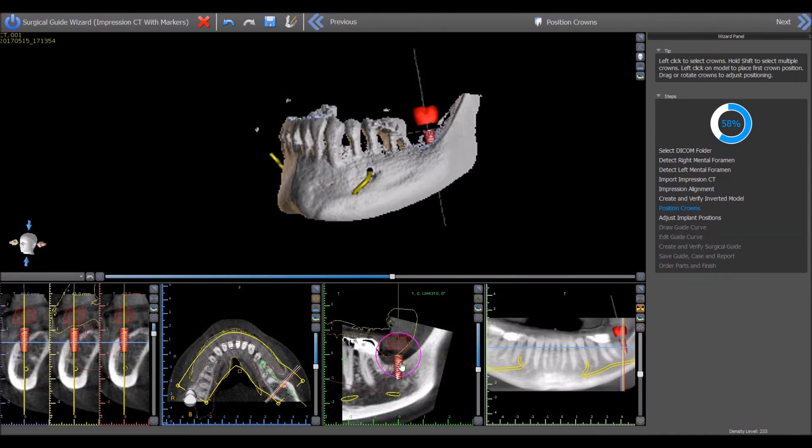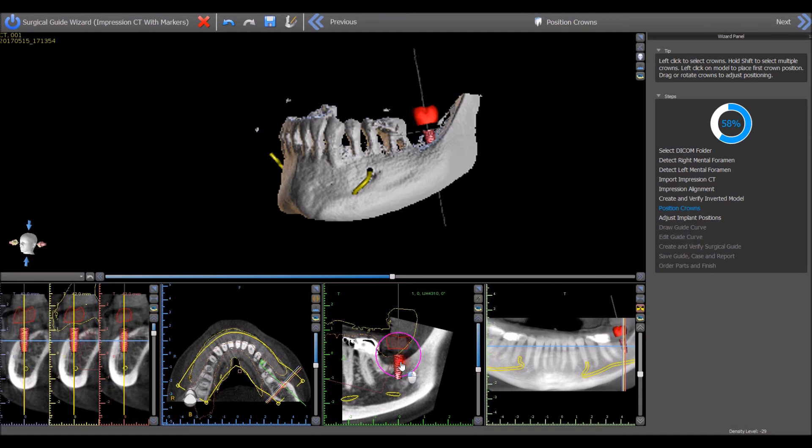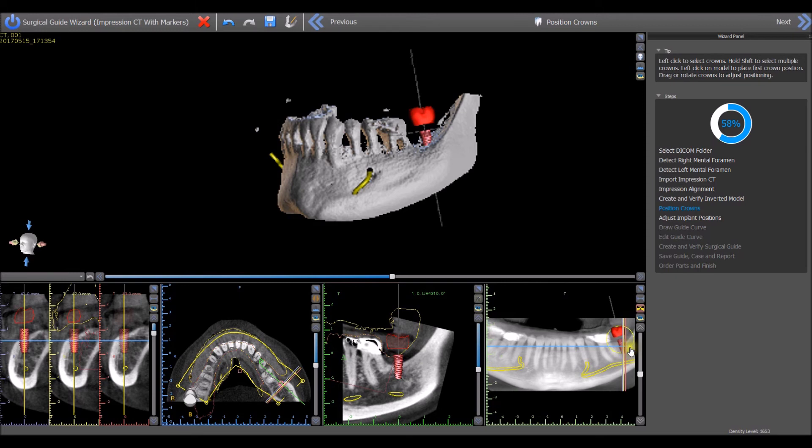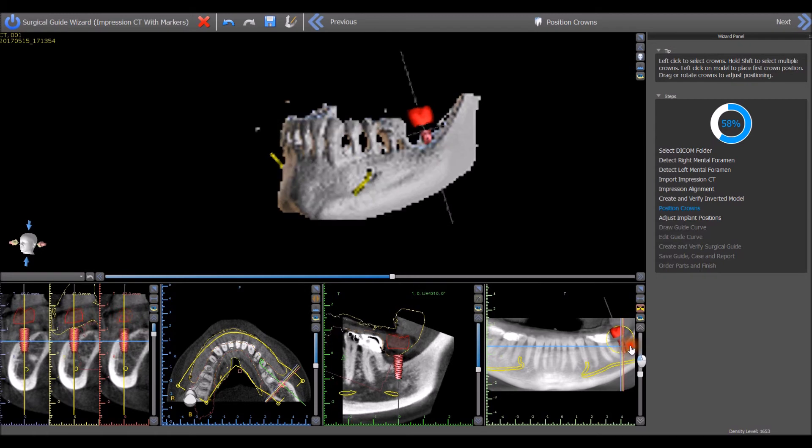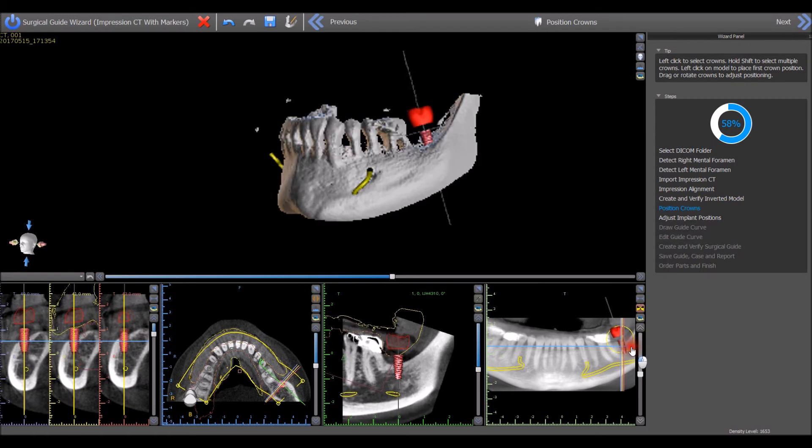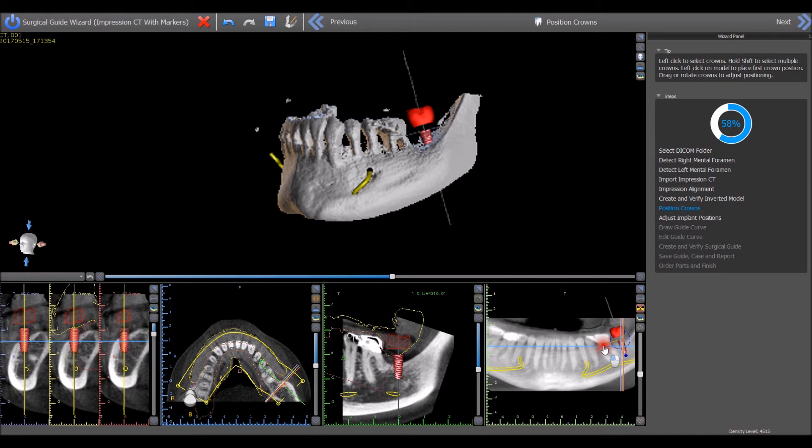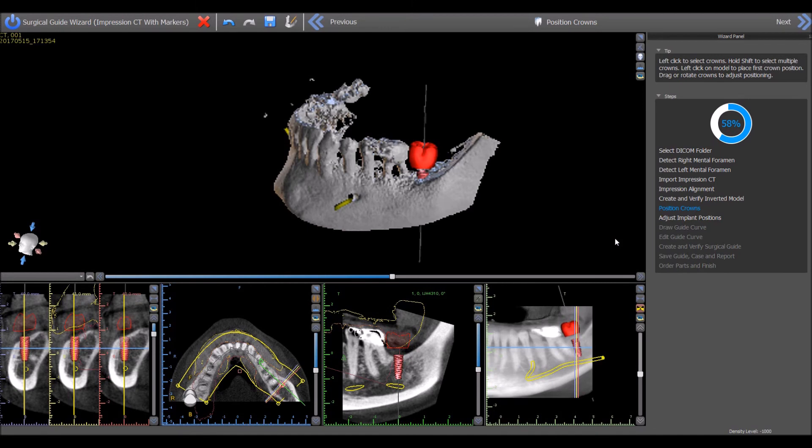Hold the left mouse button to grab and move the implant and virtual tooth to the ideal location. This can be done in any view. Moving the mouse over the implant will cause a rotation widget to appear. Hold the left mouse button to grab the widget and rotate the implant and virtual tooth. The dots that appear next to the virtual tooth can be used to resize the tooth. Once the implant and virtual tooth are in the desired location, press the Next button.